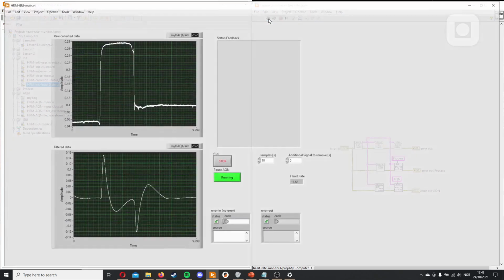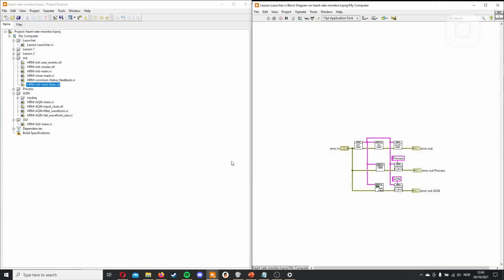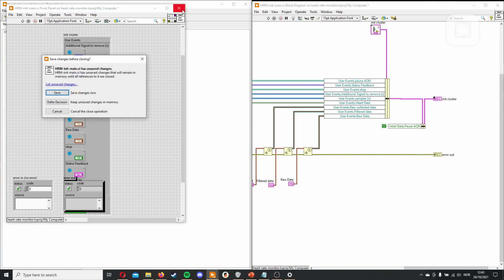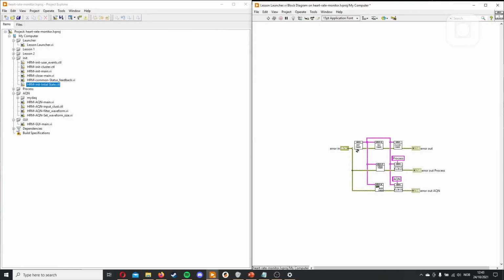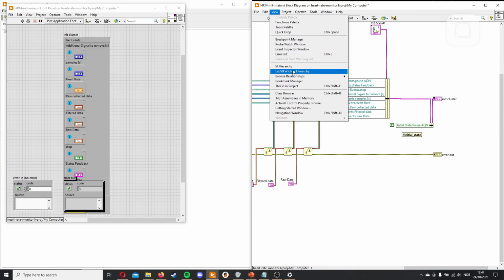So if I start the application now, both will start running as in false, and then we can pause it, of course, stop it. But if I at a later point don't want it to start, I can just change it here from a false to a true, and now it will start paused, and I will press it to start it. So that's the power of having initial values and gathering them in one place, because now everyone is dependent on what happens here, and you don't have to change it in multiple places just to update the whole application. And we can add a little comment. Initial state. By adding a hashtag in front of it, we can find it later with the bookmark manager.